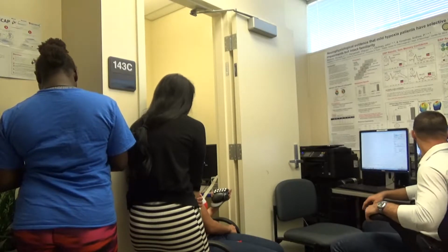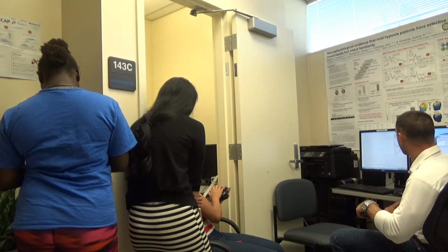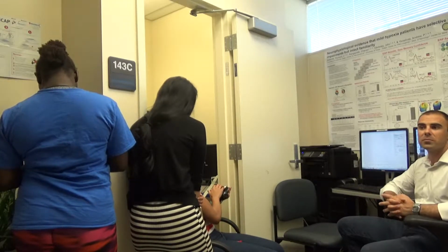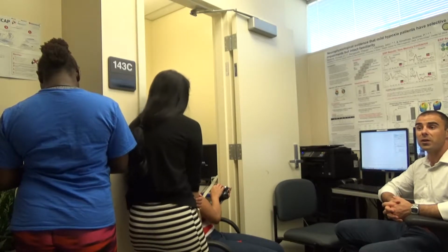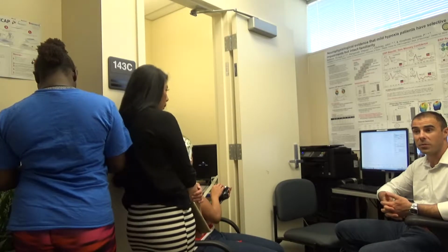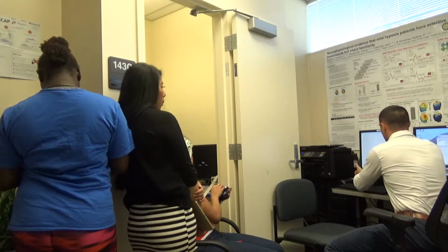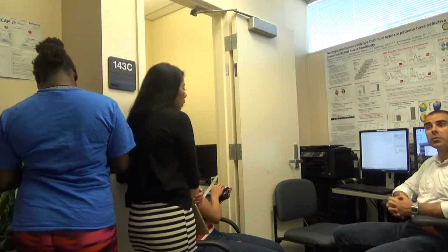Is it still going? Yeah, so just keep making those responses, and we can see your item confidence, 1 or 3 or whatever. And that's basically how we can categorize the brain activity for those different conditions that you guys are making your hypotheses about for analyzing, right? Conscious memory, non-conscious memory, attention, just confidence in general. It's little slices of each of these little windows surrounding those particular events. And it gets integrated with the EEG.